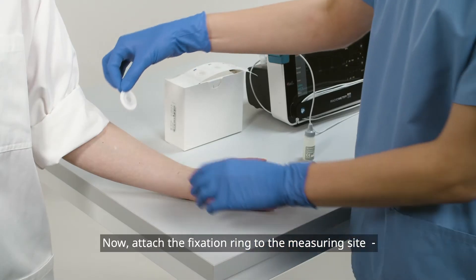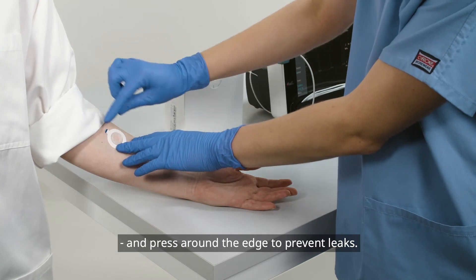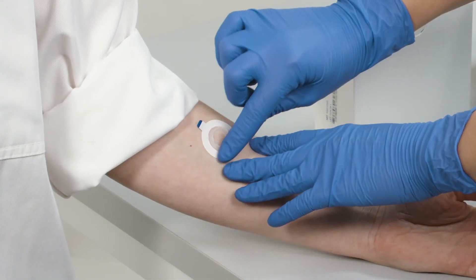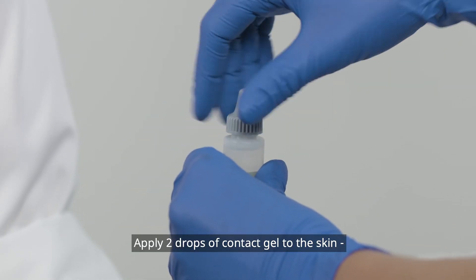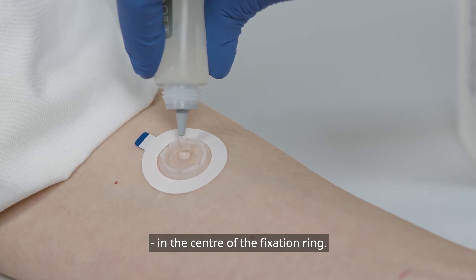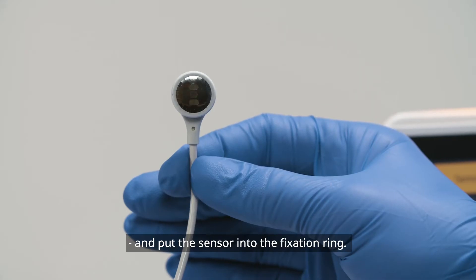Take the fixation ring and remove it from its cover. Attach the fixation ring to the measuring site and press around the edge to prevent leaks. Apply two drops of contact gel to the skin in the center of the fixation ring.